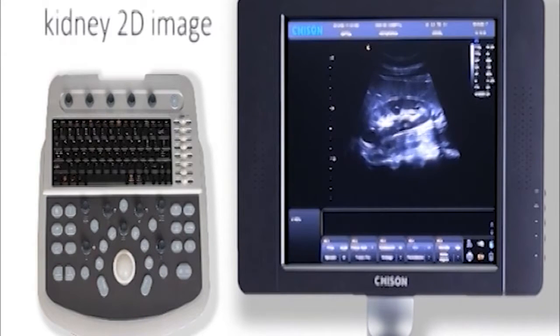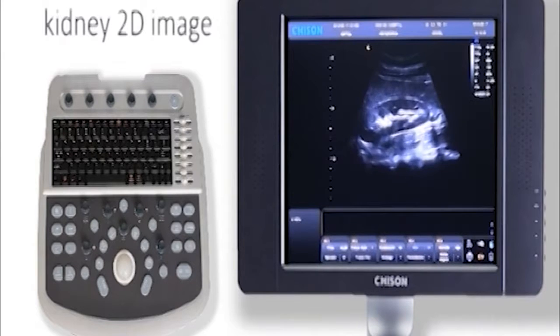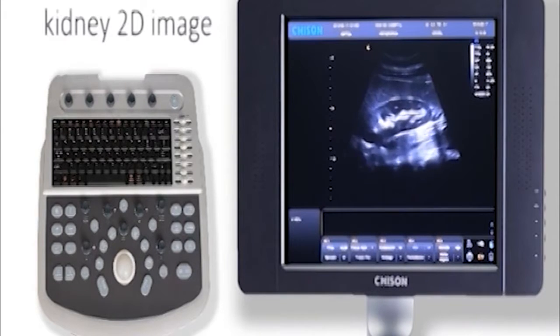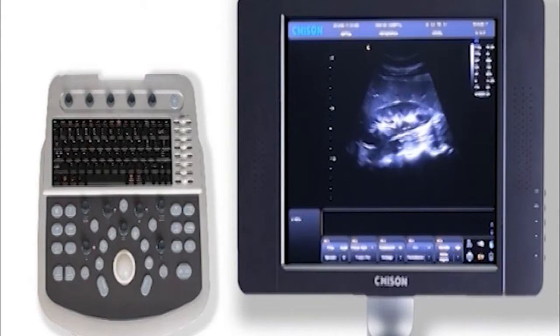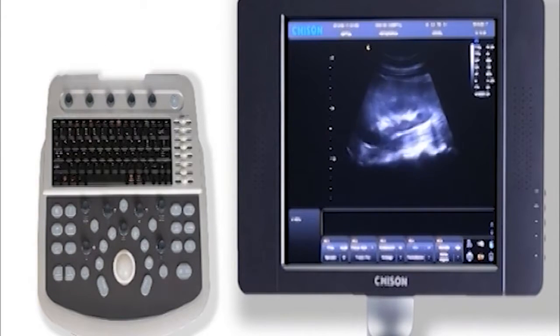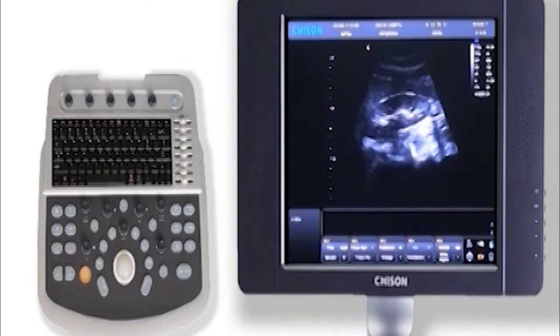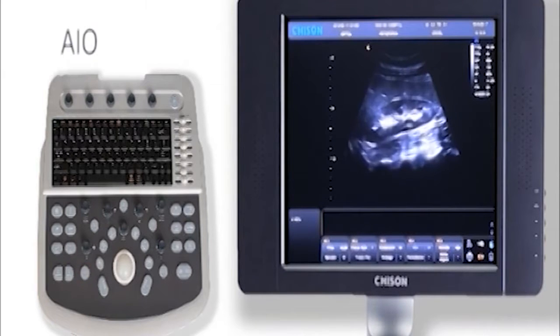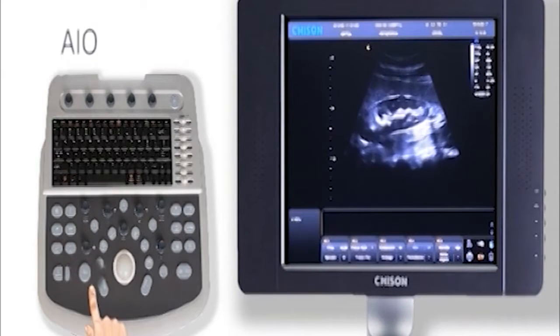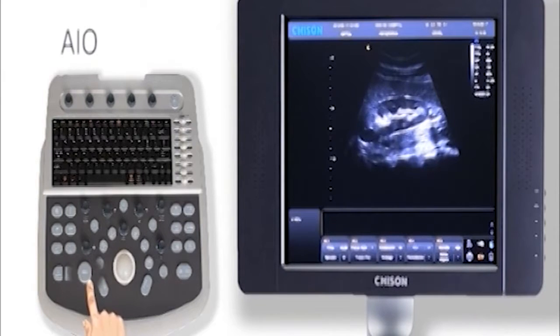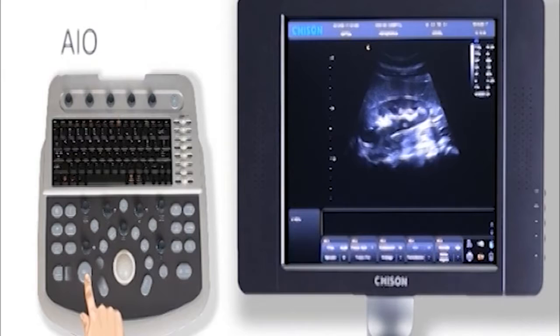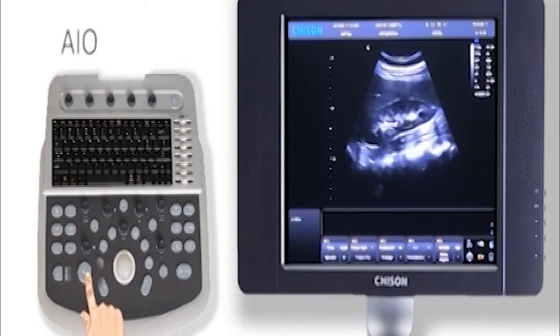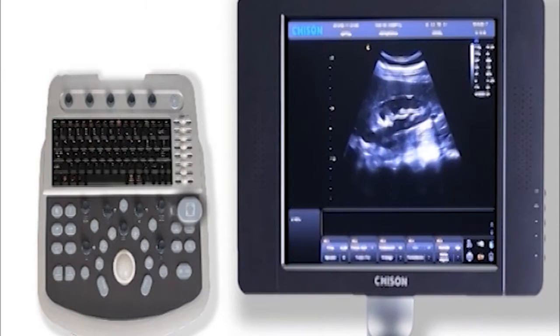Let's get started in kidney 2D image. Now we can get an image on screen. Here is AIO, automatically image optimization. According to the real situation, press it to reach an ideal image level.